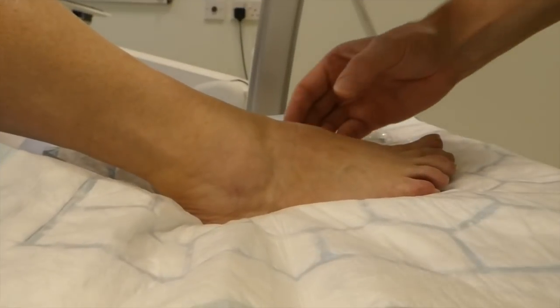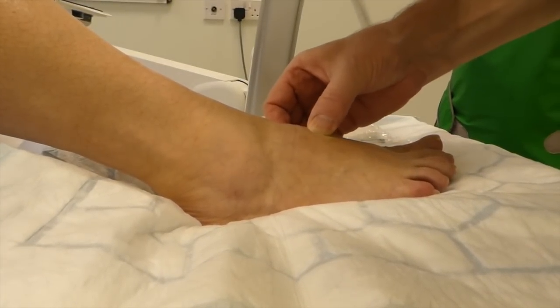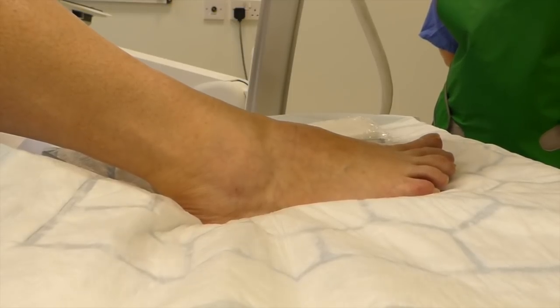This lady has got a painful right second metatarsocuneiform joint. We need to give this patient an anonymous name. We'll call her Jillian.